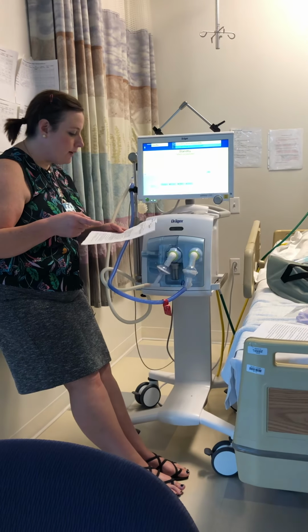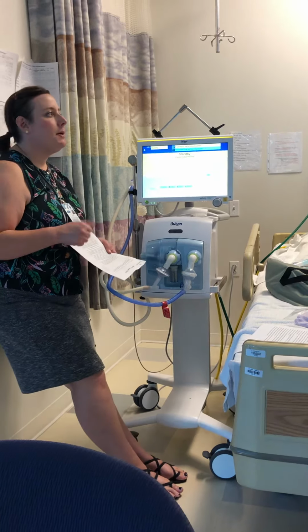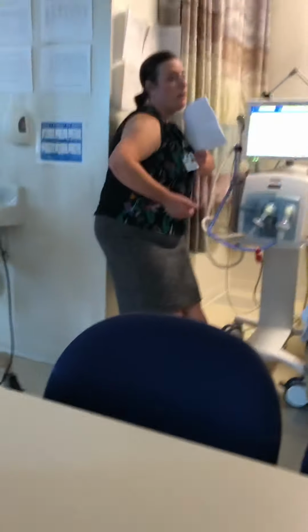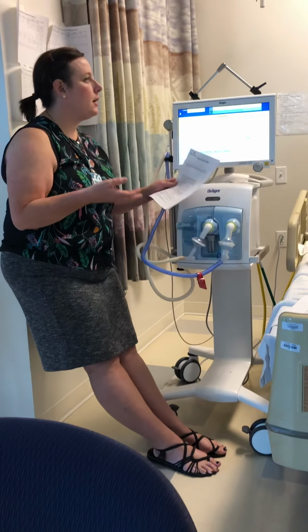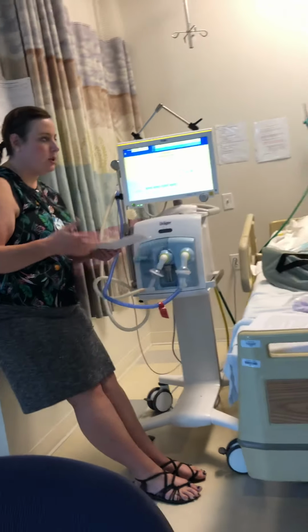Review the patient chart for significant findings. Does this patient have a CDH that we know about that makes non-invasive support not compatible with their disease process? Do you know that they have a pneumothorax? And maybe we want to look more into how much pressure we're going to use, things like that, okay? Identify and gather the necessary equipment that you need for the event.